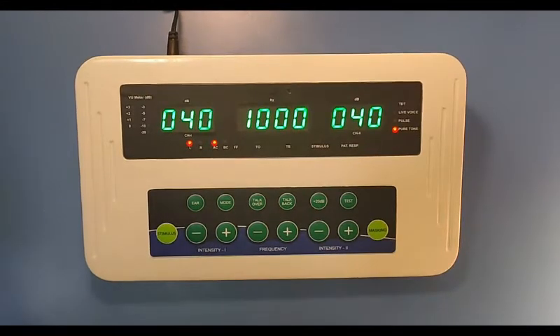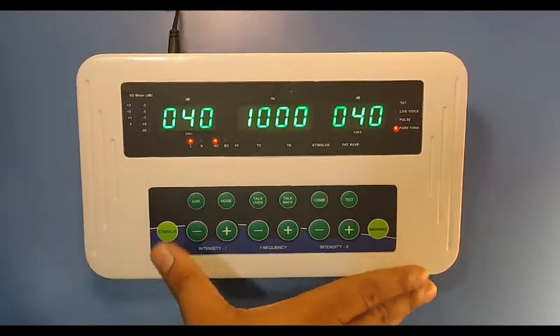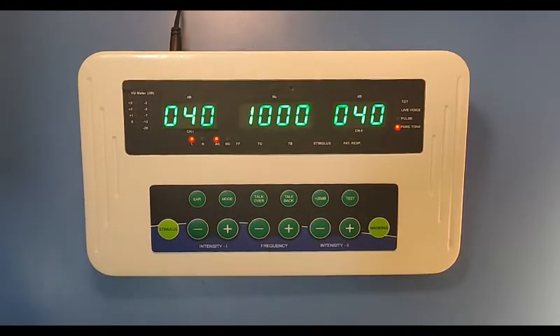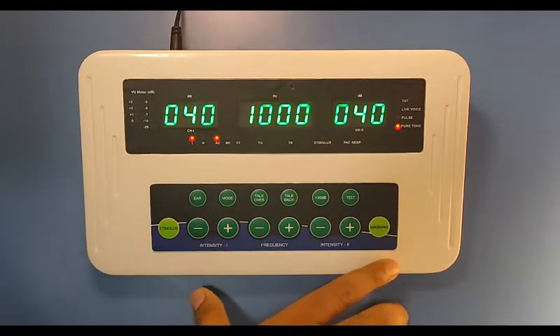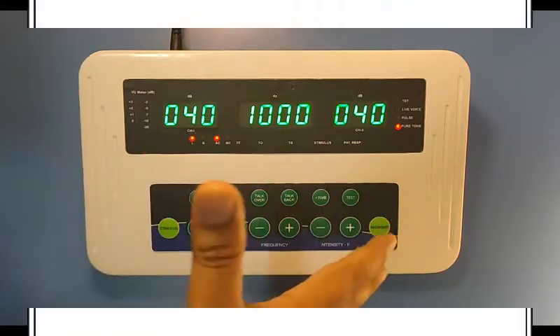This is the model Audio Mini. This is the main console. It's a standalone audiometer and it is also mobile application based, where you can operate the audiometer using a mobile app. It has padded key operation. It's very portable and lightweight, and as you can see, it's very compact in size.